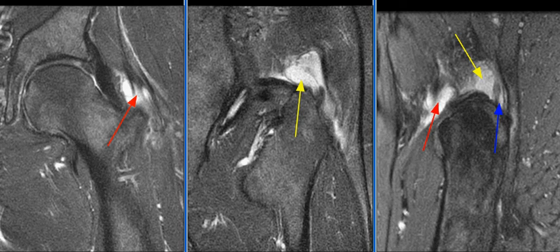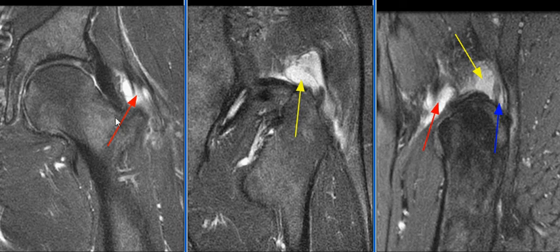A 67-year-old male with severe left hip pain after a fall. MRI examination shows complete avulsion of the gluteus minimus tendon from the anterior aspect of the greater trochanter with approximately 1.2 cm of tendon retraction.